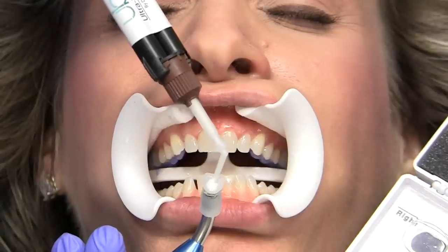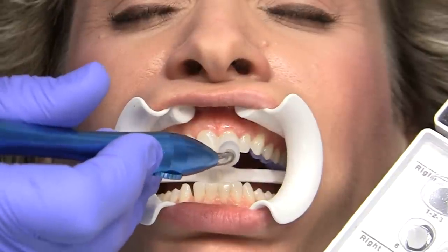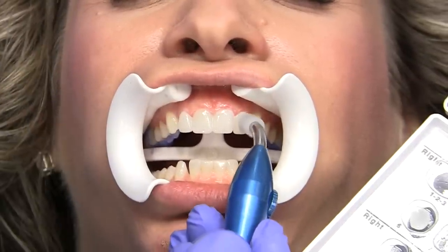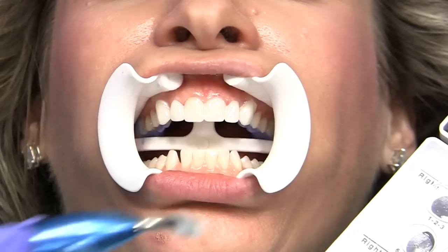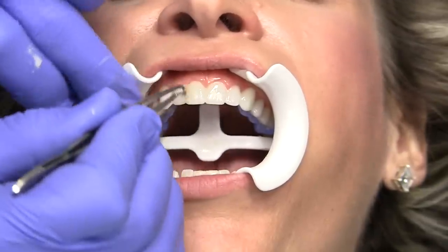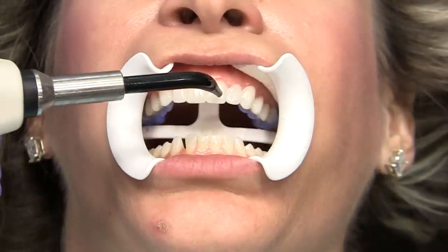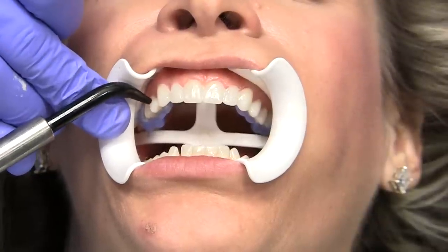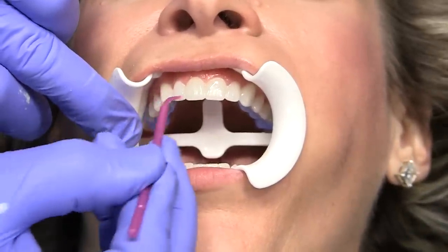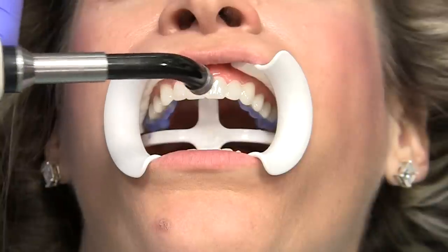Select the appropriate shade of Ultrabond Plus Resin Cement and apply to the prepared lumineers and put in place. We recommend using the LumiGrip and holding it over the patient's bib to avoid dropping the lumineers. After placing the lumineers, remove the excess Ultrabond Plus with a soft brush coated with Tenure S. Using a 9mm tip with a Sapphire Arc curing light, completely cure all the lumineers, exposing each surface for 5 seconds.